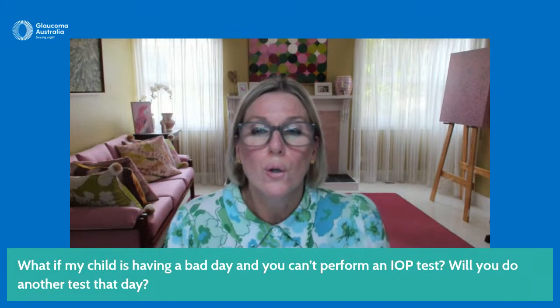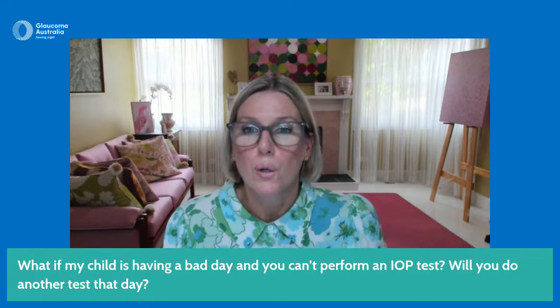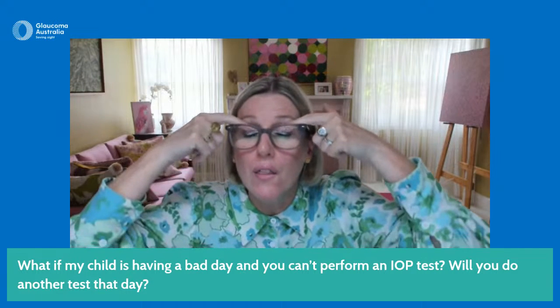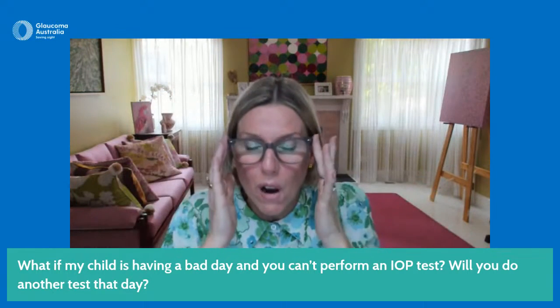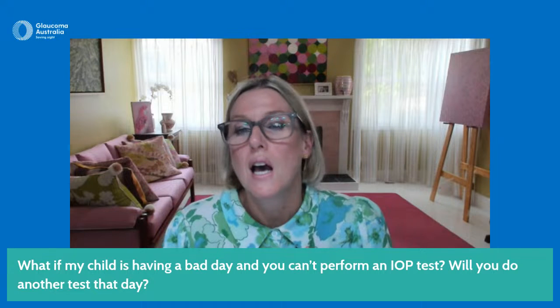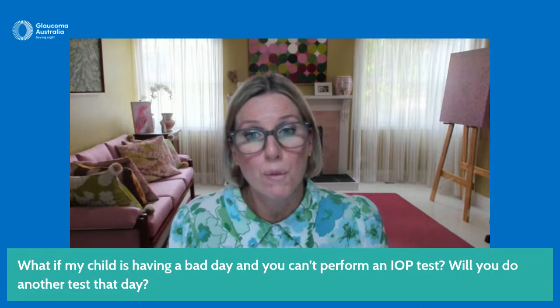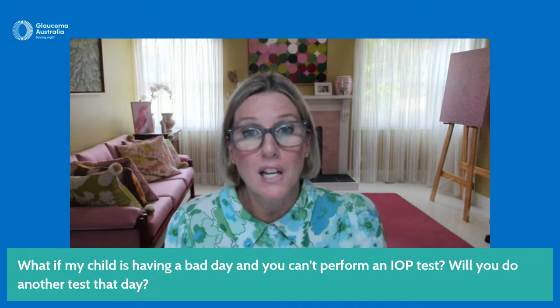What if my child is having a bad day and you can't perform an intraocular pressure test? Will you do another test that day? So we do look at all the tests that we're able to perform on the day to put together a picture. Sometimes there isn't any other intraocular pressure test we can do other than feeling the pressure within the globes physically by putting our fingers on the child's eyes. And if we're unable to get any intraocular pressure test that day, then the ophthalmologist will make a decision based on all of those other tests that were performed that day, plus your feedback.